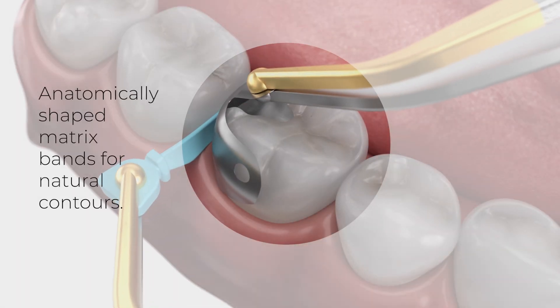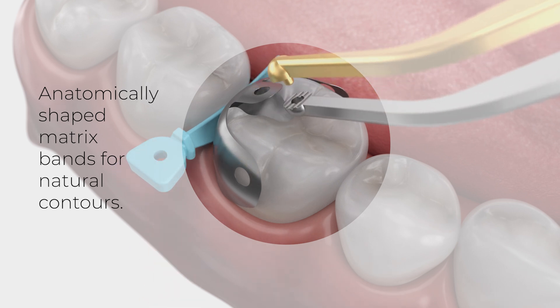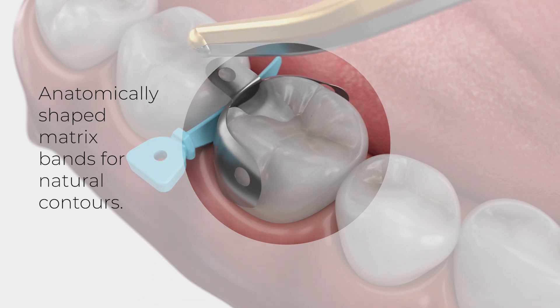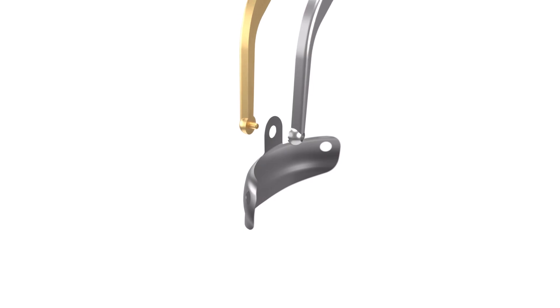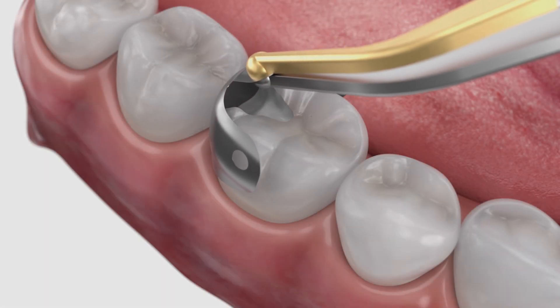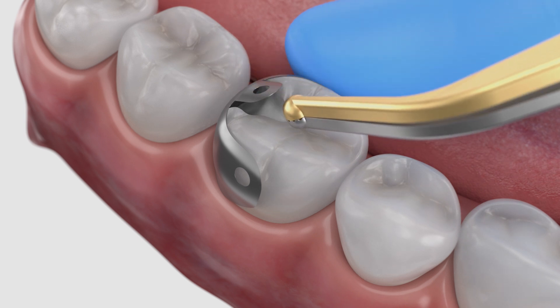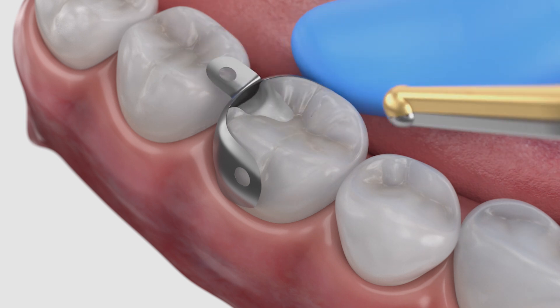After removal of the metal shield, insert the Paladin Plus matrix between the wedge and the cavity prep. Alternatively, if you choose to cut the prep without using a wedge guard, you can begin with the placement of the Paladin Plus matrix band. Using the pin tweezers, bend the tab to make placement easier.